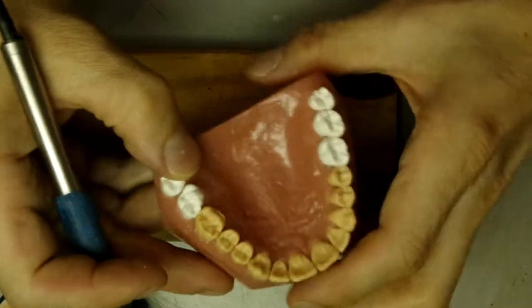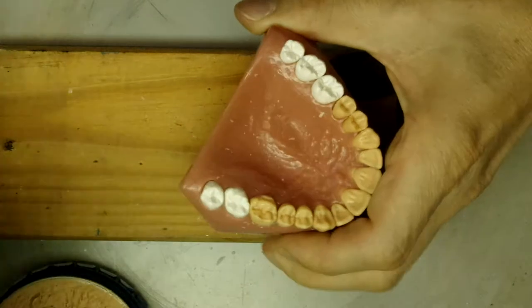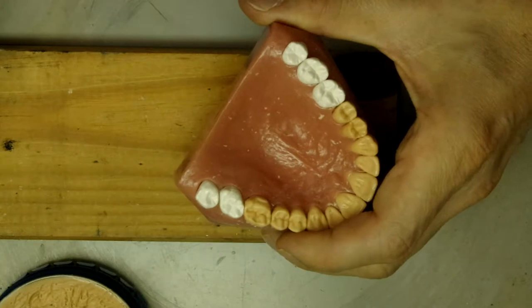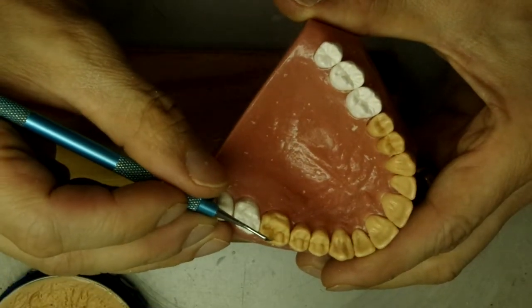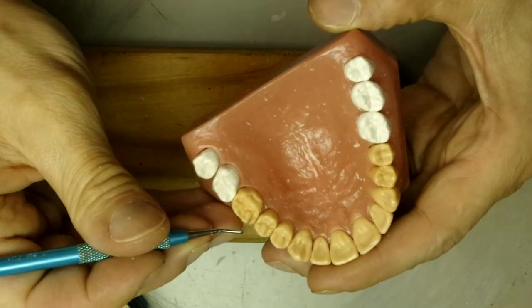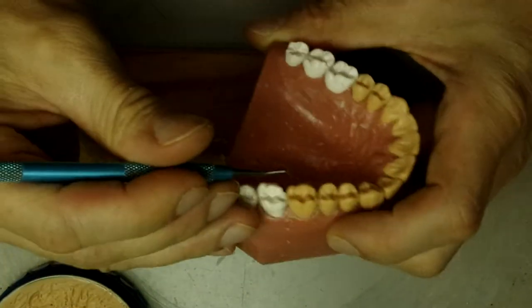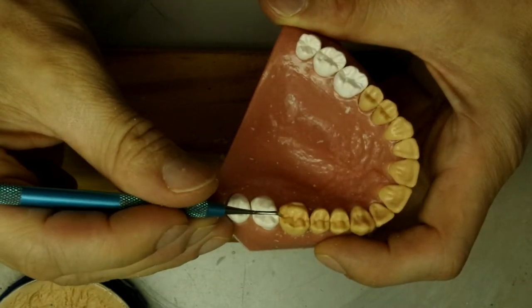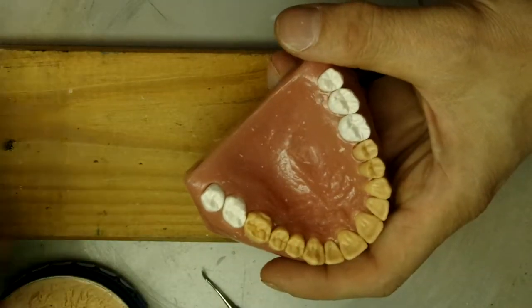We're going to take a look at the occlusion and refine it a little bit. If we look over here, we have a little bit of space, so we have to fill this in. We'll have to puddle this area in a little bit, and this area here - it's a little too open.